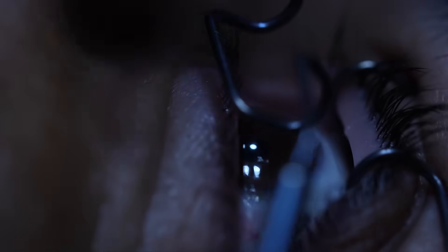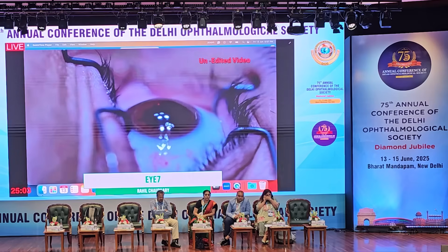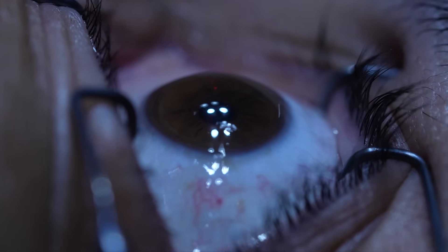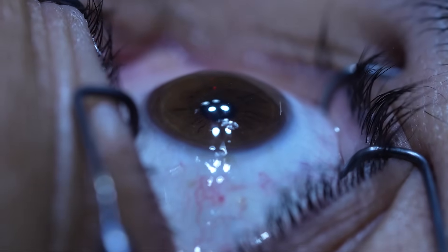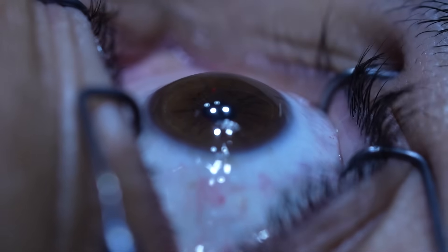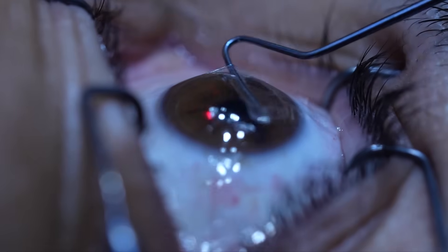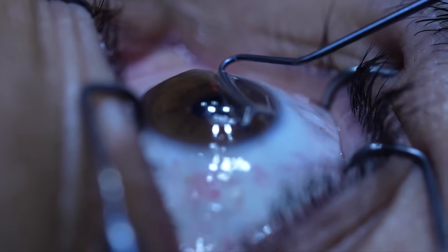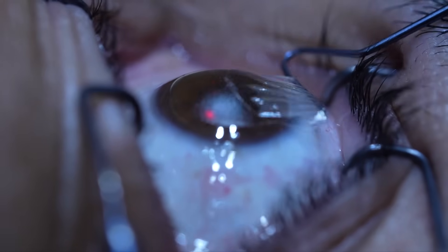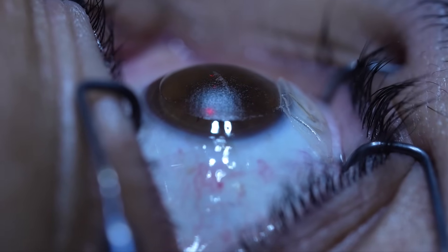Speculum on — the flap has already been made. I use the silk ELITA machine to make the flap. The flap thickness is 120 microns and the diameter is about 9.2, because we are working at an ablation zone of 9. Starting off with the procedure — opening the side edge. Both options of doing the procedure with or without the flap are now possible. Opening up to the hinge, then opening the full flap, retracting it back and folding upon itself, so that the flap is always protected.